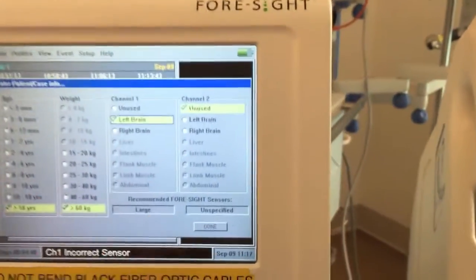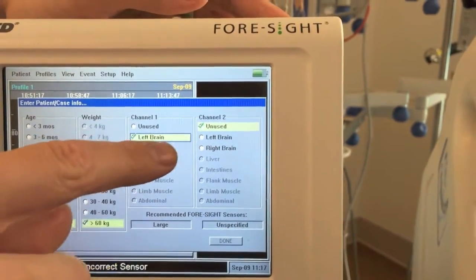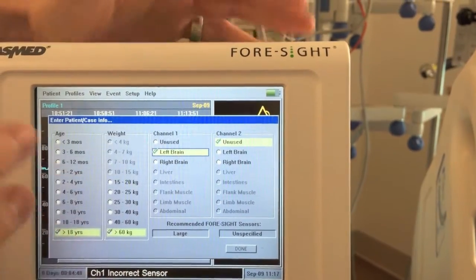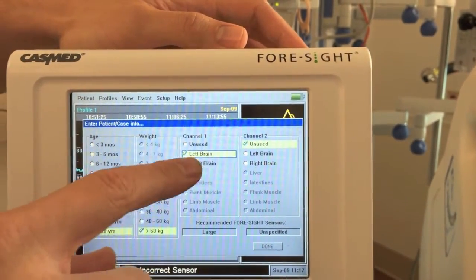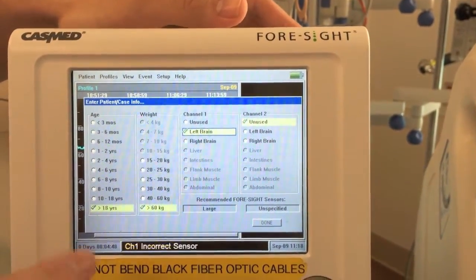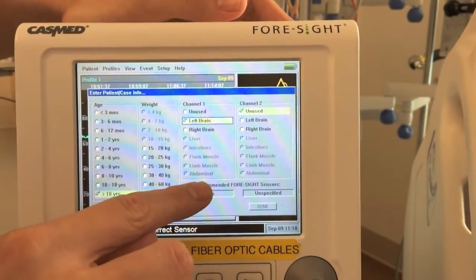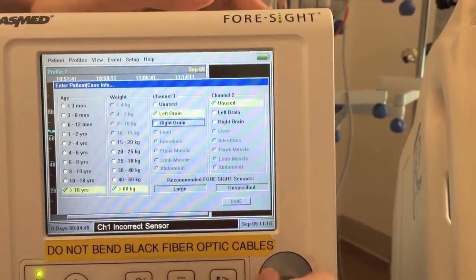Channel 1 is our default channel that we'll use for monitoring, selected for left brain, which we'll use for all of our patients just to have some consistency with readings and measurements. Channel 2 says unused, and it's pretty uncommon to be monitoring from both channels or both sides of the brain.